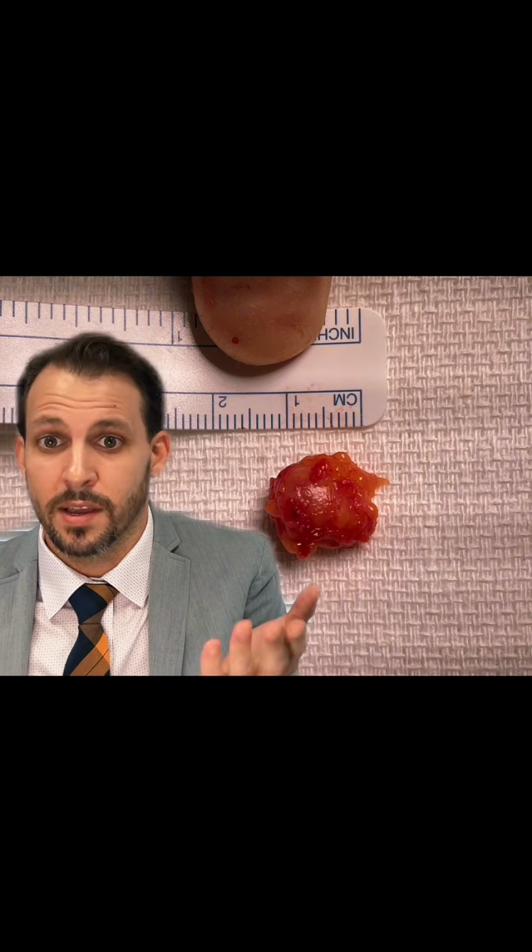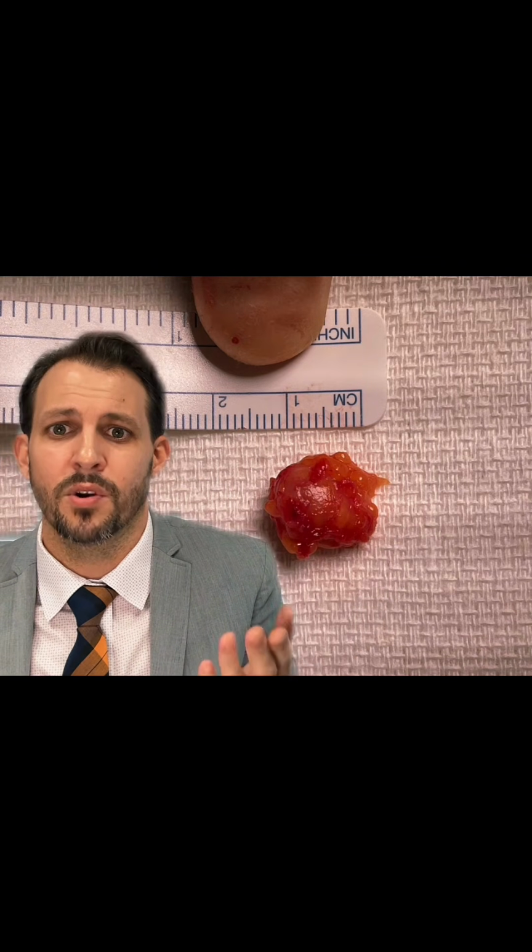And again, look at the images, because if you ever encounter this, again, this is in the United States. This is probably one of the first cases, if not the first, of filariasis documented in the United States. But that's what it looked like, and this is what it looked like when we took it out. It's actually just a mass. And the true diagnosis, the hospital system won't be able to get it. You have to send it to the CDC for special staining and analysis.